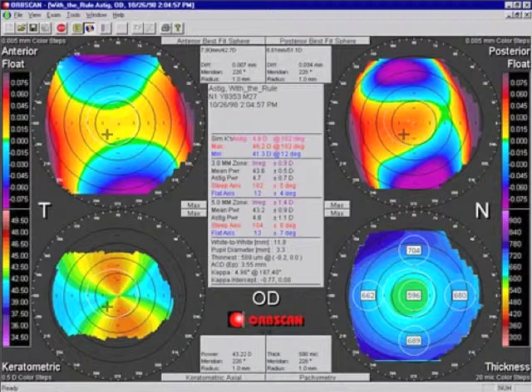Because keep in mind, all of these devices that are measuring the reflection from the cornea, whether it's keratometry or topography, are directly measuring radius of curvature and are then deriving from that the dioptric power at all these different points to produce our dioptric power map. Keep in mind, we're looking at this map, we're saying, this area is 46 diopters, this area is 42 diopters. But those are derived measurements. They're based on assumptions that are not always true, assumptions that certainly do break down if someone has had excimer laser surgery.